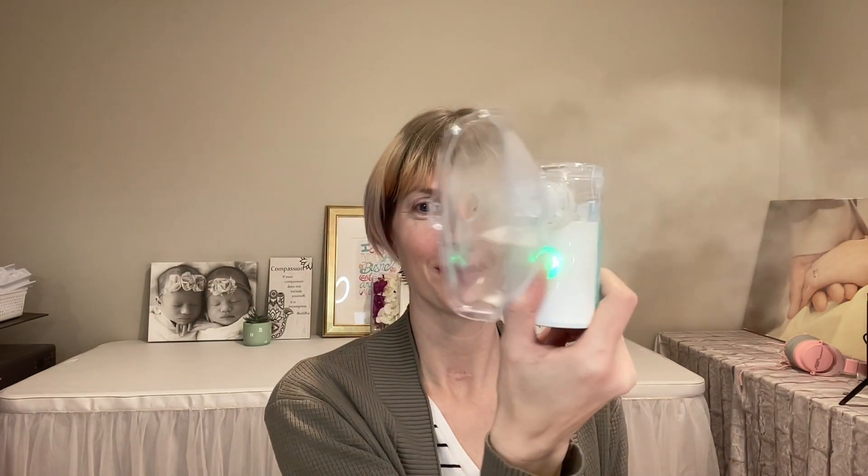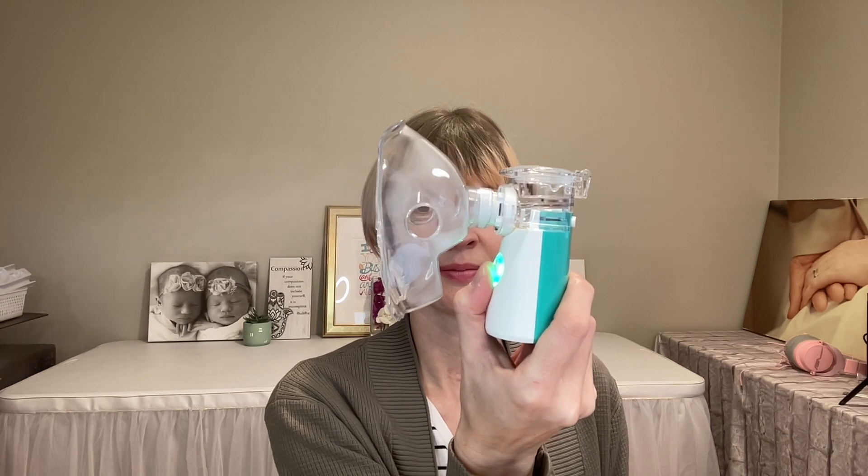This innovative ultrasonic mesh nebulizer atomizes water-soluble medications into aerosols smaller than 5 microns, which are easily inhaled into the lungs and bronchia.